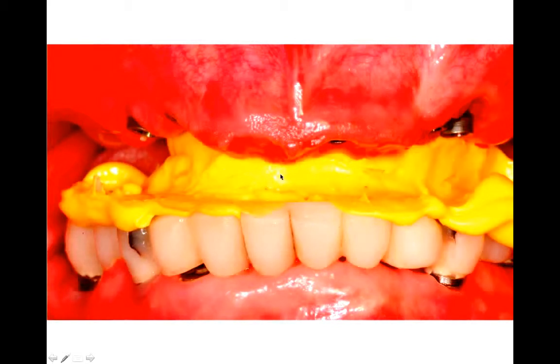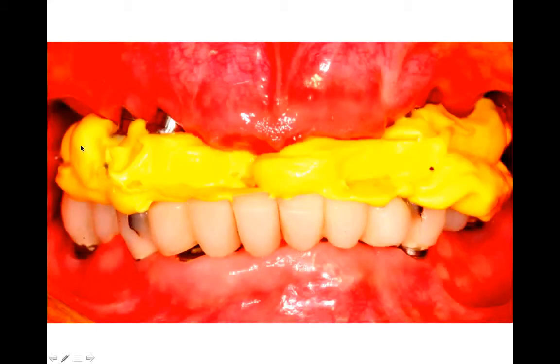And then it goes back into the mouth. So the bite was taken, and then you can take the bite out of the mouth, take the temporaries off, remove the abutments, place your implant bite posts, and then place the index back in the palate. It orients nicely. Have the patient close back into the bite, and then you can inject material around your bite posts, and then you have an accurate bite record against the lower provisionals.